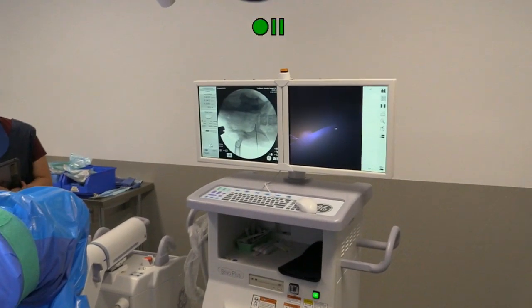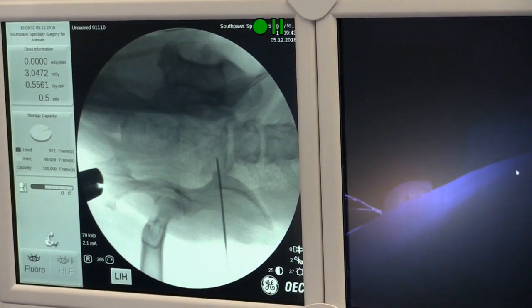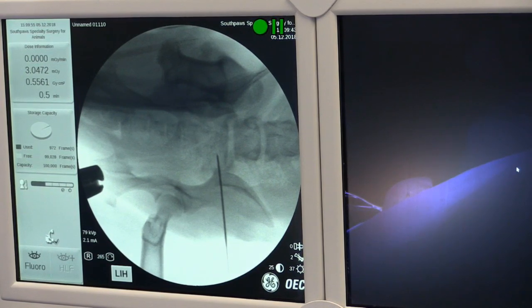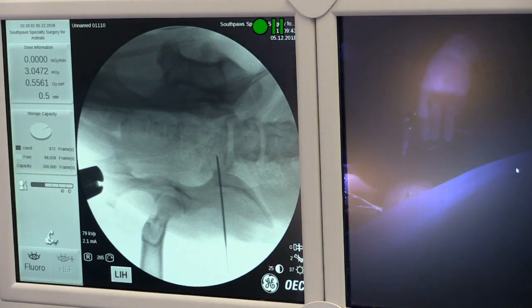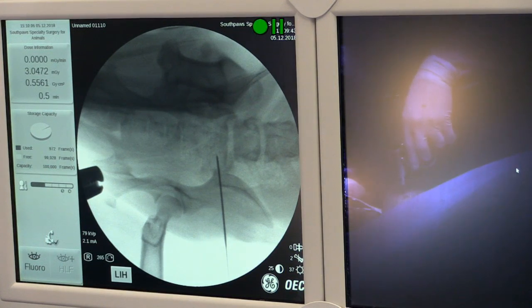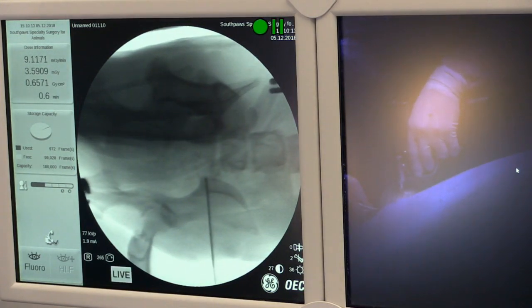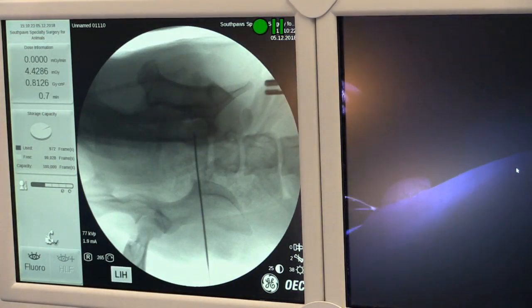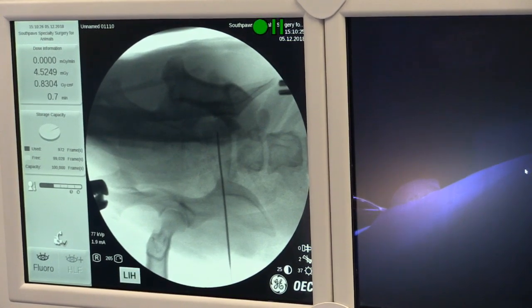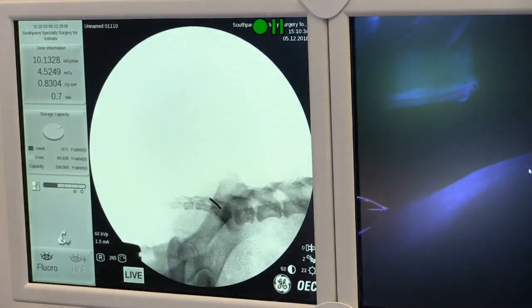Okay, so you can see on that positioning, the reduction is not quite perfect, so I actually want to get the little wing positioned a little bit further forward from where it is. The alignment overall is not too bad, so I might just try and reposition that a little bit. Let's see if we can get a little bit tricky here. Having fluoroscopy is really helpful when you're doing these minimally invasive procedures. In fact, you really can't get away without it. Well, now we'll do the other orthogonal view, which will be a lateral shot, and we'll see how that looks.